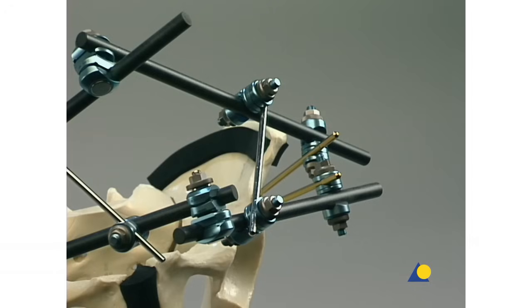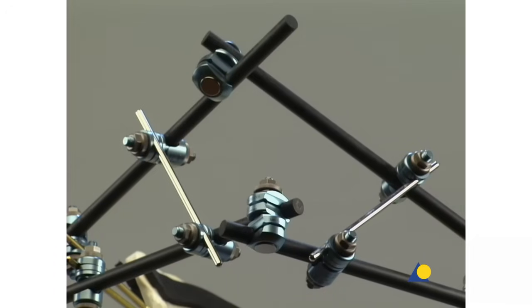Two additional clamps and a connecting rod are attached to the contralateral side in the same way.